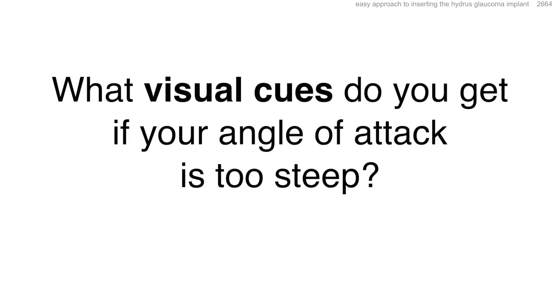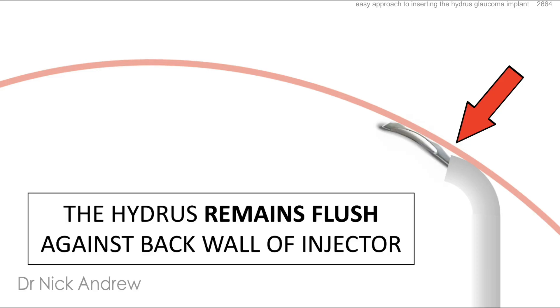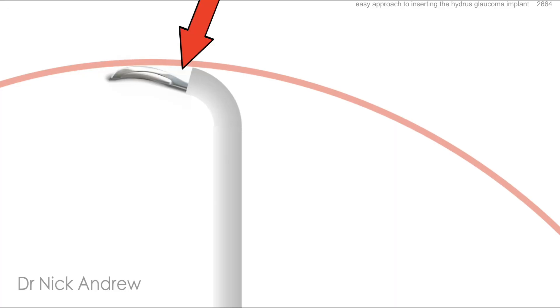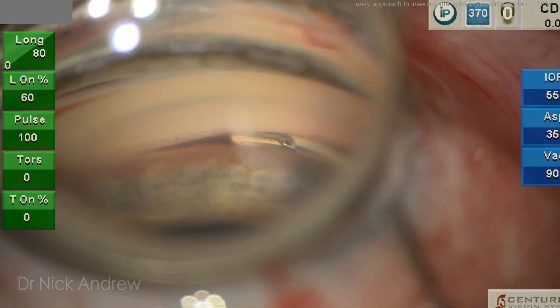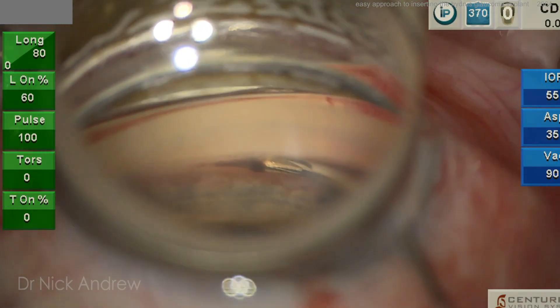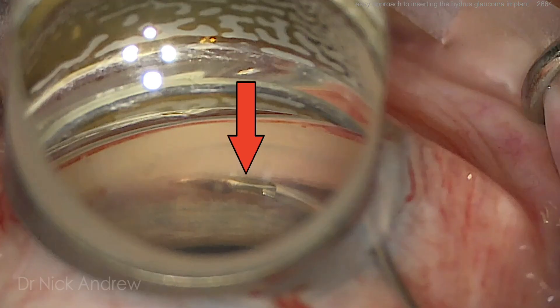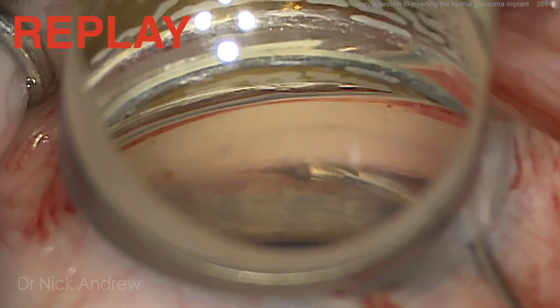There is an important visual cue if your angle of attack is too steep. With a flat angle of attack, as the first window of the Hydrus is advanced, you'll see the Hydrus remains flush against the back wall of the injector. In contrast, with a steep angle of attack, the Hydrus will strike the outer wall of Schlem's canal and be pushed away from the back wall, forming a visible gap. If you see this gap form as the first window is advanced, stop and relax your hand.